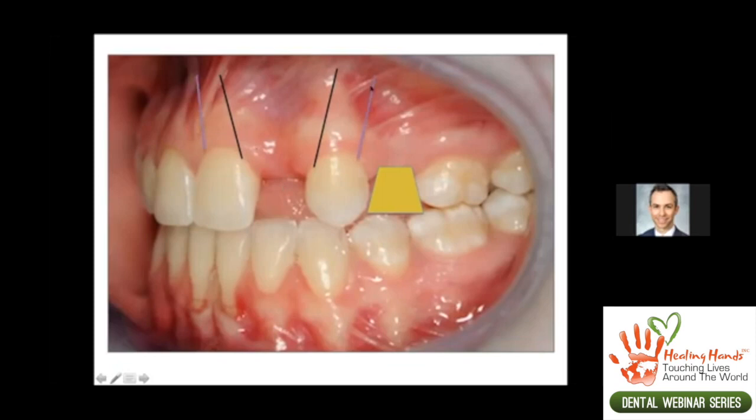We can take the incision further away and we can place vertical incisions further back. Some people, if you have a high smile line, are concerned about some gingival scarring showing when a person smiles, although I haven't seen much scar tissue form from these. But one of the reasons I don't like this option is because when you close over your bone graft, sometimes you lose a little bit of length and you may not be able to pull this gingiva all the way back to the papilla. And so that again may leave you with a defect right over the labial aspect of the canine or the central incisor tooth.